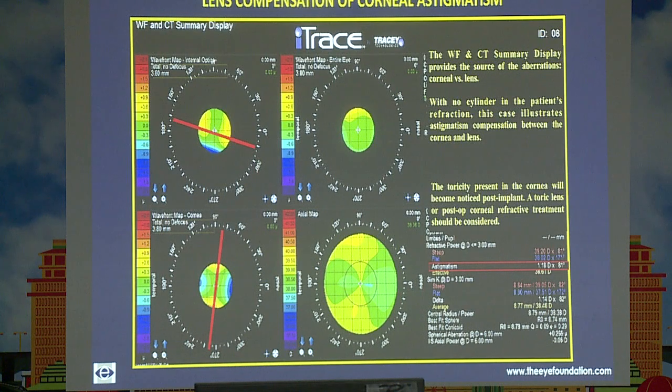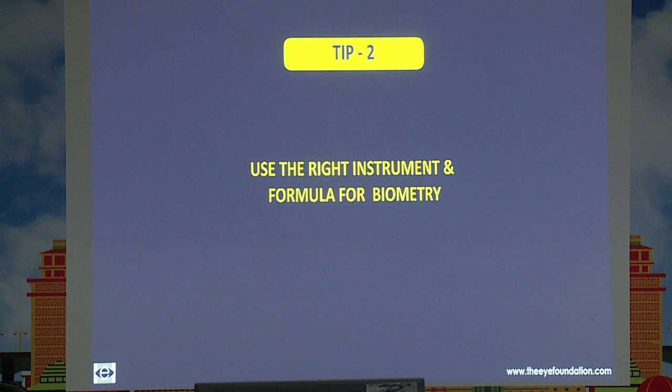Contrast that with this case where the internal optics and the anterior corneal astigmatism tend to cancel out each other, so that right through the life of the patient, he or she has not been wearing an astigmatic correction in their glasses. But once the cataract comes out, this anterior corneal astigmatism is going to become manifest, and obviously this patient would qualify for a toric intraocular lens.